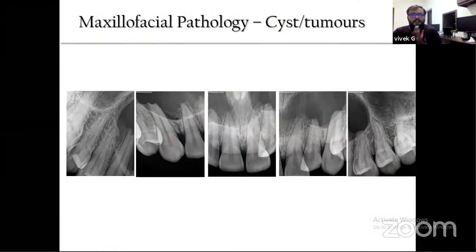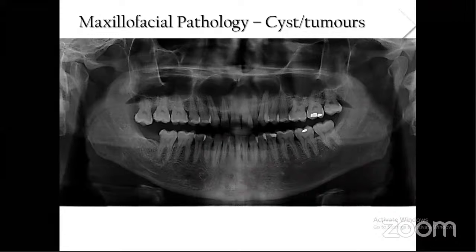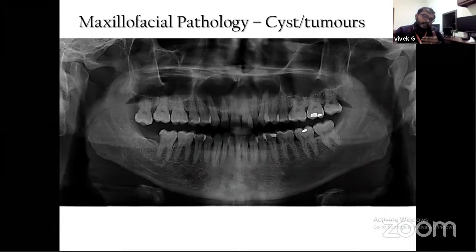Now again, I was talking about oral surgery. We were talking about impactions. We were talking about orthosurgery, planning and evaluation. Now about pathologies. These are some of the cases that might come to your clinical practice day in and day out. Here, for a single pathology on the maxilla, a very large periapical lesion, the doctor had to go in for 5 radiographs to actually get the boundaries. Even then, they couldn't get the superior boundaries. A panoramic radiograph will help you with it, but how far palatally it is extended can't be visualized with the help of a panoramic radiograph.